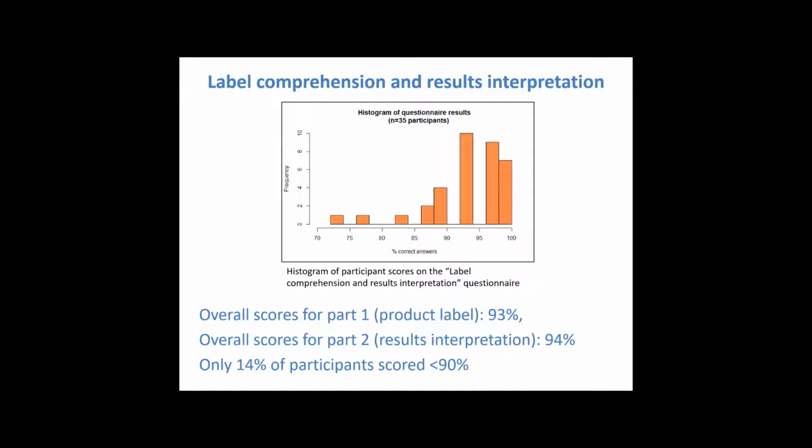We also noticed that the technician focused on G6PD results without always noticing if hemoglobin was between 4 and 7 grams per deciliter. For example, the automatic warning only shows if the hemoglobin level is less than 4. Next slide, please.